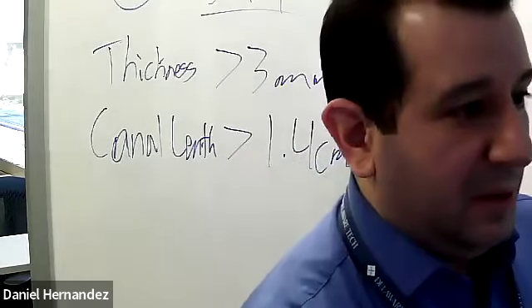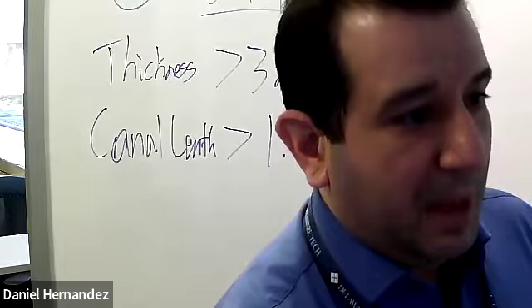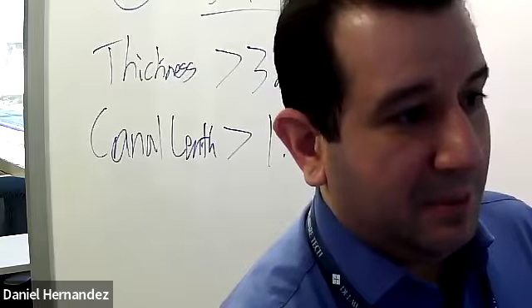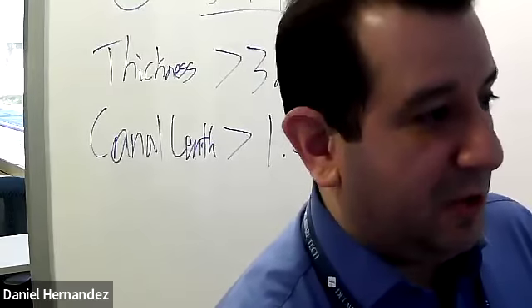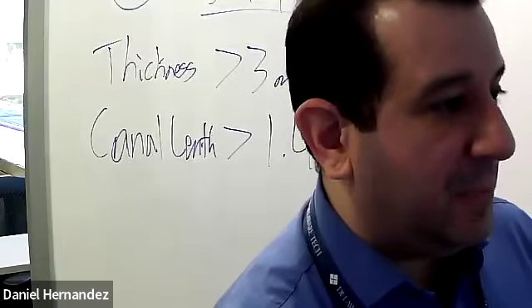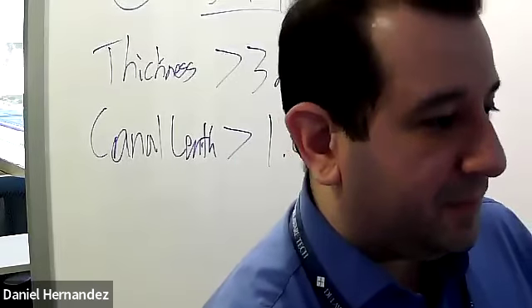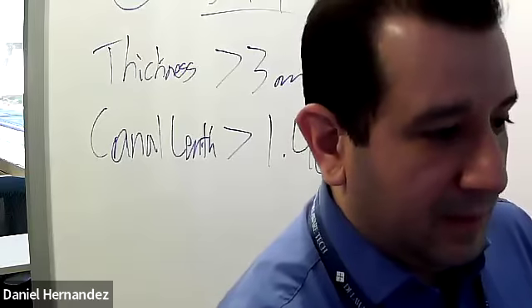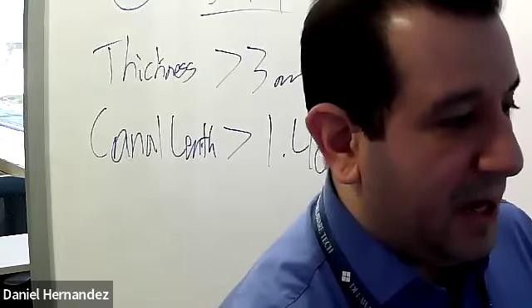If we suspect it, we see the walls of the bowel appear thickened. We've got some echogenic gas bubbles within it, and then this posterior dirty shadowing as a result of those gas bubbles. So, the bacterial necrosis. Another area here, the echogenic gas bubbles, some dirty shadowing.